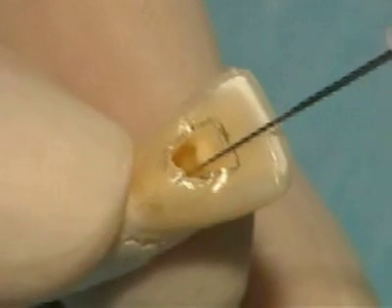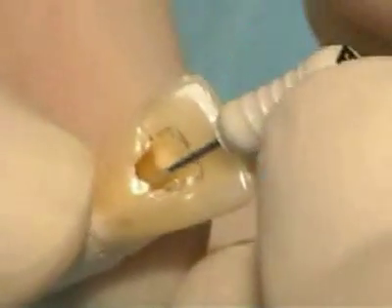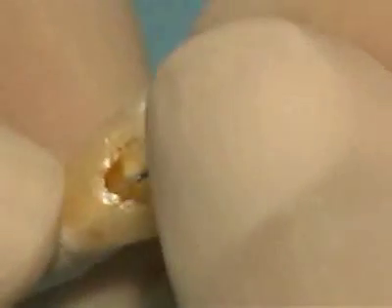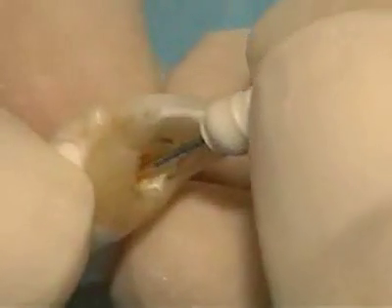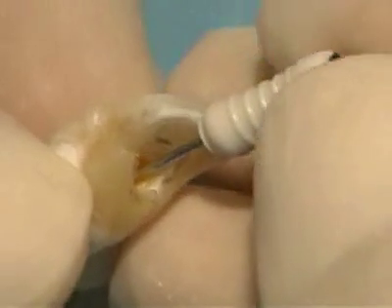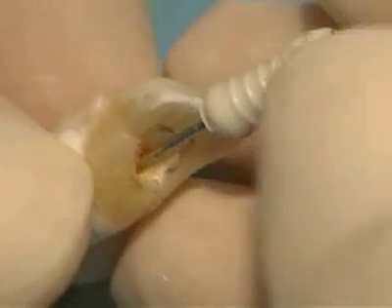Verify that you have achieved straight line access by rotating a file within the canal. The file should have direct and unimpeded access to the canal, achieving 360 degrees of unrestrained motion. You should be able to rotate the file 360 degrees about the cavity outline without encountering resistance within the pulp chamber due to ledges or ridges.